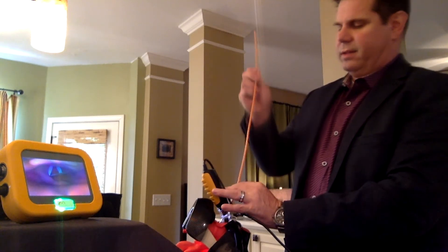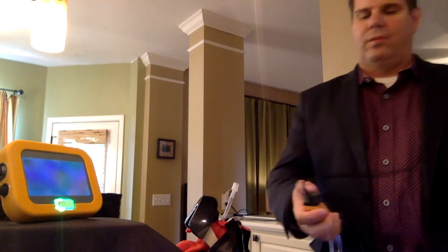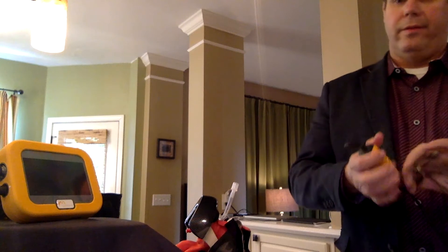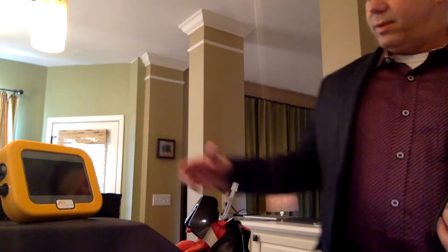Once we have the ET tube in, we'll remove the bougie. Then same process — we're going to disengage the sheath into the trash and then turn off the battery. Now you're saving the battery and it's ready to go.